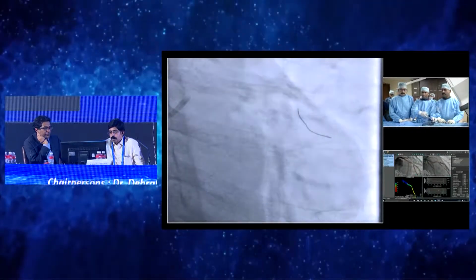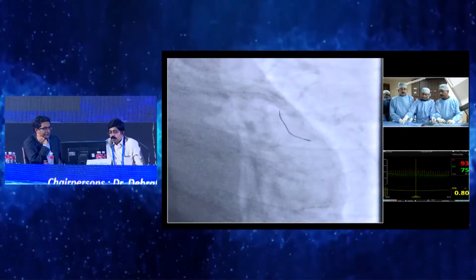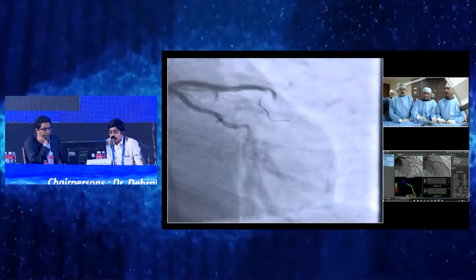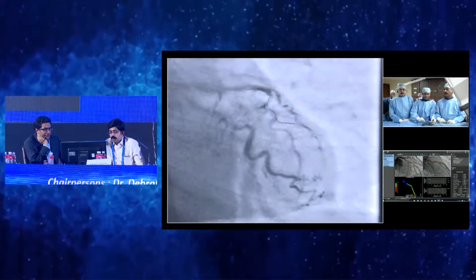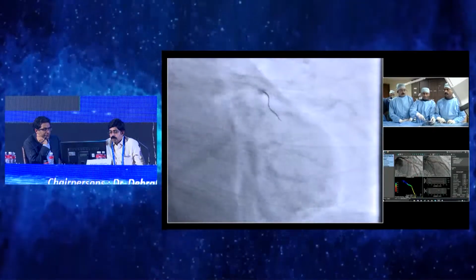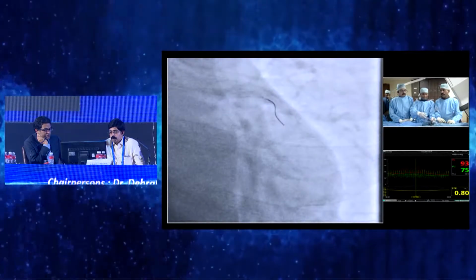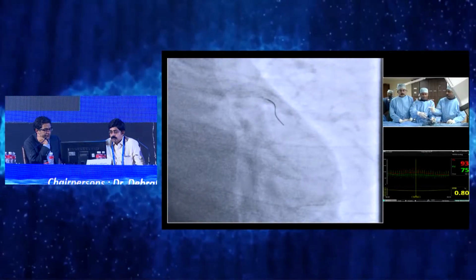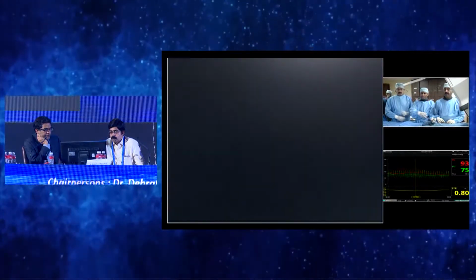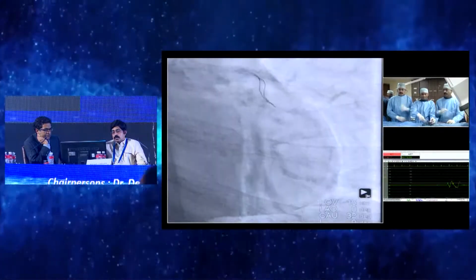Okay. So can the QFR be assessed prior to stenting? What would be the QFR if you put a 3 by 48 millimeter stent? Does it tell us? Post-stenting QFR, can it be estimated? Yeah, we can do that now. We'll show you that live. The value, FFR we can see as well as QFR we can see. Sure. Can we go to the cranial view?